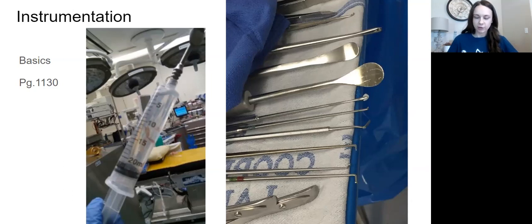As we keep going, I've gone through most of these instruments so far. So let's look at suction tips. So it says Frazier or Adson. You need to have lots of Frazier suction tips in different sizes. So I want you to think of this like ear surgery. Even though the lumens aren't quite as tiny, you need to have lots of different sizes available because we're doing microsurgery when it really comes down to taking the tumor out usually.